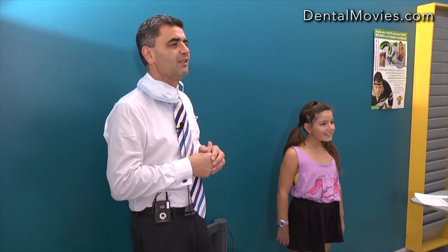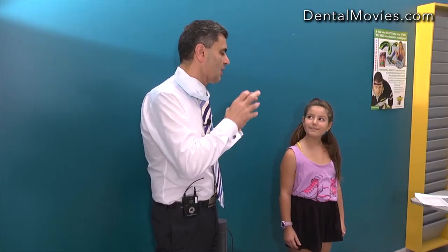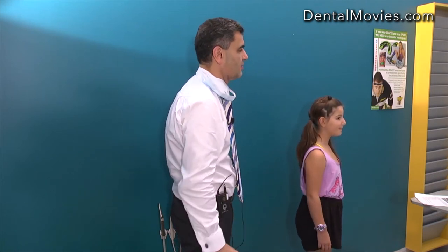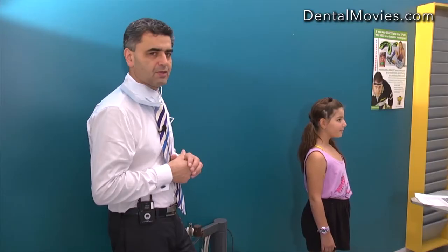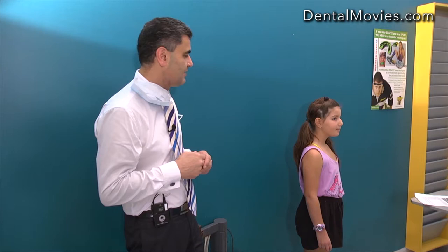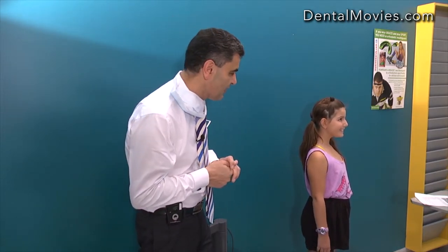Next we take two more photos: one smiling and one not smiling, with the patient looking to the side like a school photo. This is called the oblique or 45-degree photo, and we take it with and without smile.